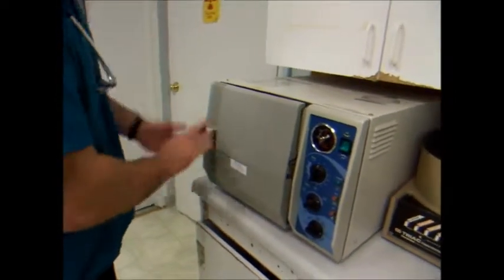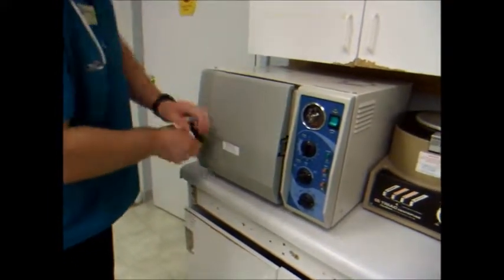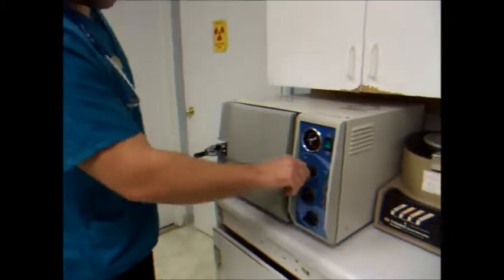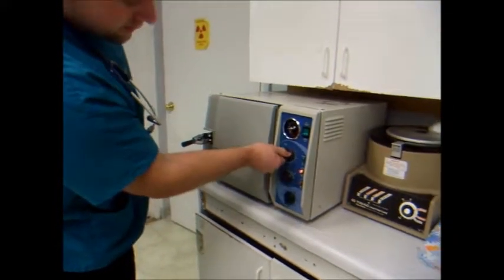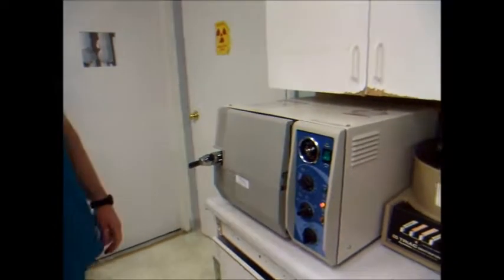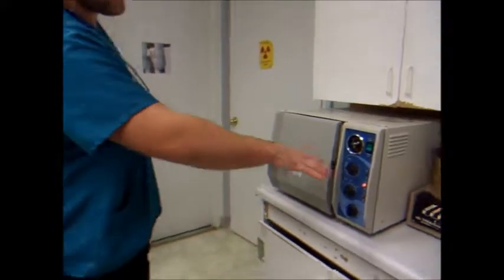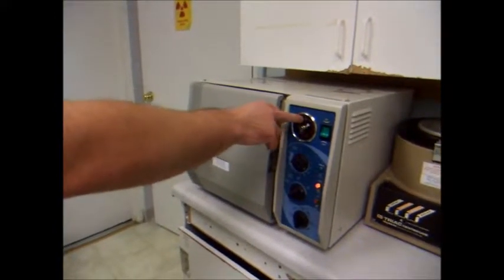We're going to run it for 25 minutes under the sterilized section. 5 minutes at 273 degrees Fahrenheit. And this is the pressure gauge here, we usually get up to about 274 here.